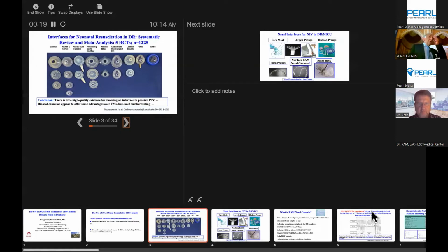Okay, so very quickly, you can take a coffee break. I was talking about the nasal interfaces that we use in the delivery room. There are a number of interfaces we use. Basically, the study concluded that there is little high quality evidence to choose a particular nasal interface. Binasal cannula appears to offer some advantages, however, it needs further testing.